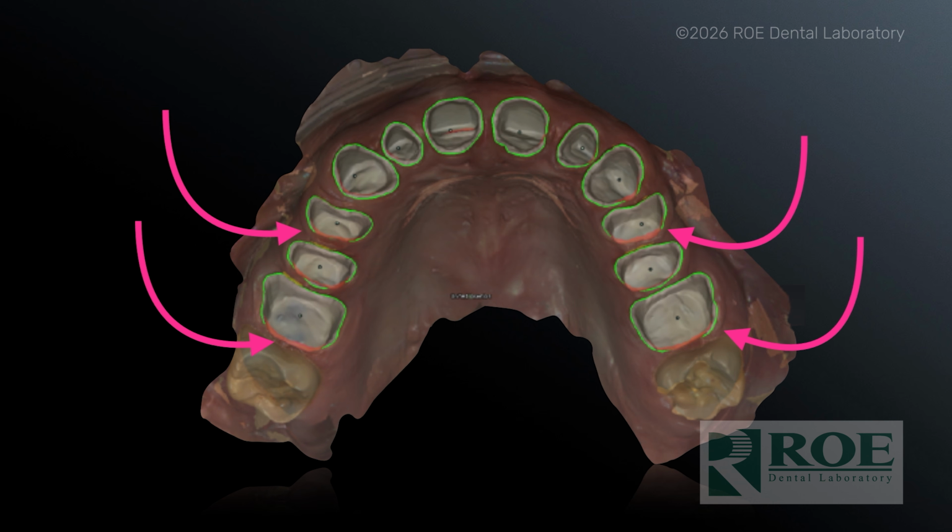And so they're just going to basically take it on a digital surveyor, and they're going to block out those areas. The problem is those blocked out areas, because your temp will seat, the blocked out areas are at the margin. And the benefit of these digital prototypes is we get to test the marginal integrity. We allow the tissue to heal to the margins. And so when we pop these off, when we do full arch, a lot of times they've got inflammation in those areas because it was an open margin. Okay. So don't do that unless you actually have draw, which is rare.